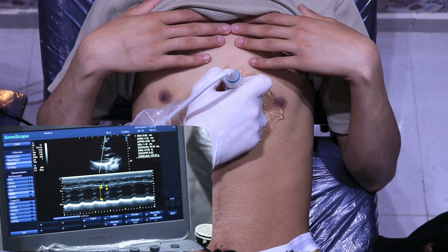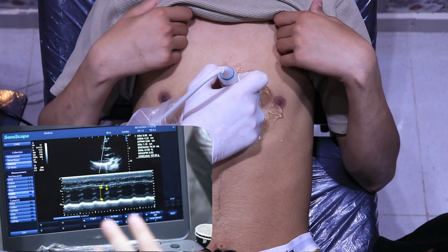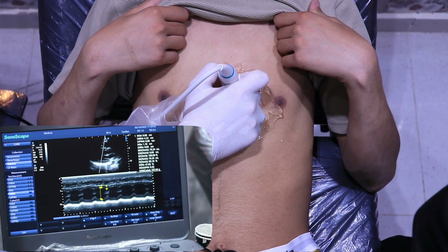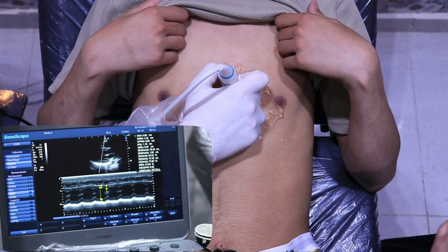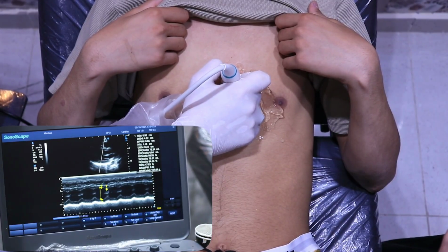لو كان العيان ده عنده بقى akinesia هتلاقي measurements are the same. يعني usually scar tissue they don't move. خدت بالك ازاي؟ فما فيش shortening. Okay? So this is the septum during systole. وبعدين هنشوف بقى دلوقتي الايه؟ هنشوف ال internal diameter of the... I'm sorry, هو ايه اللي حصل؟ Let's just exit. We'll go back to calculator.